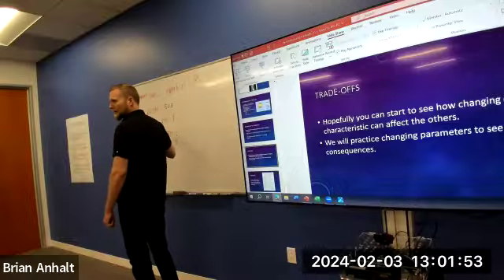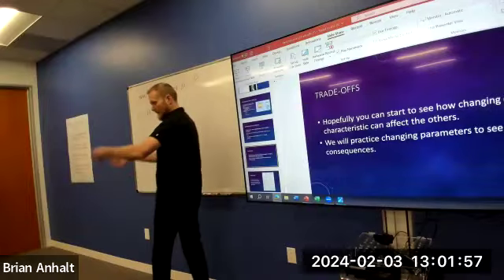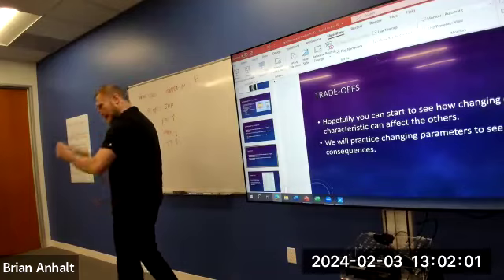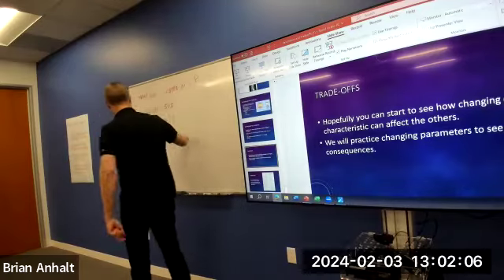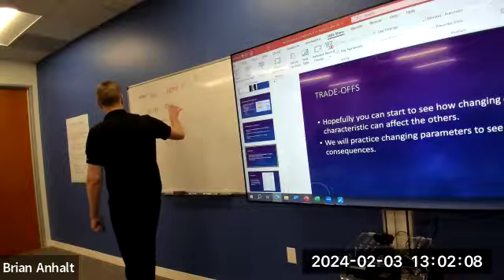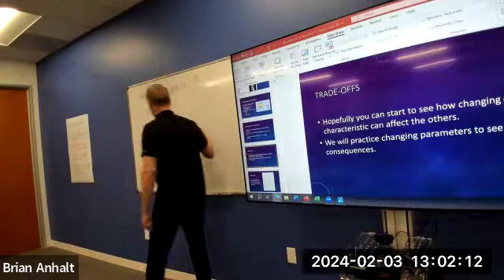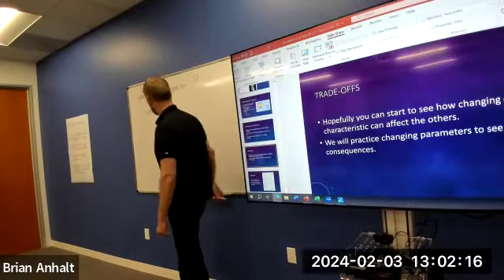They see a high number on there, they think that means big voxels. It doesn't. Always think about a square pizza or a square birthday cake. The more pieces you cut that into, the smaller that little piece is going to be, right? So the higher the matrix I have, the smaller the piece gets. So if I lower my matrix, my SNR is going to get better. What else though? This is not the only thing that controls SNR. What else can I do?